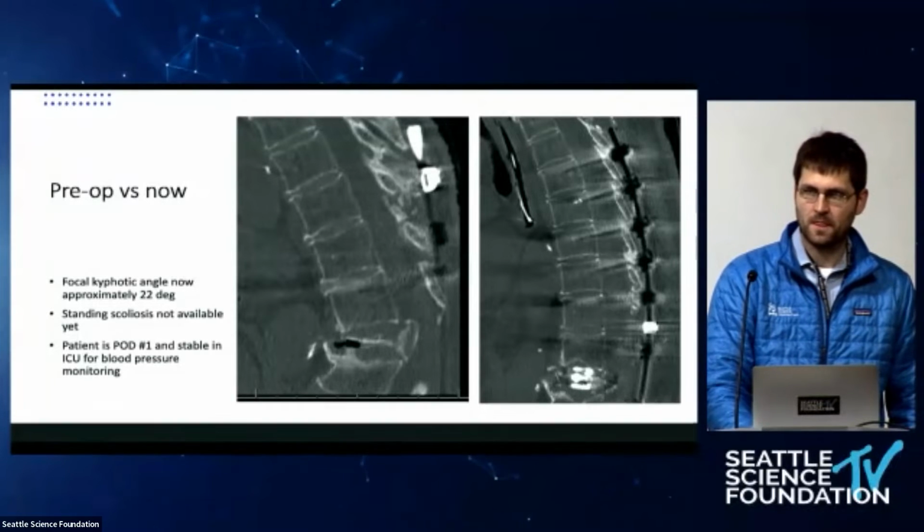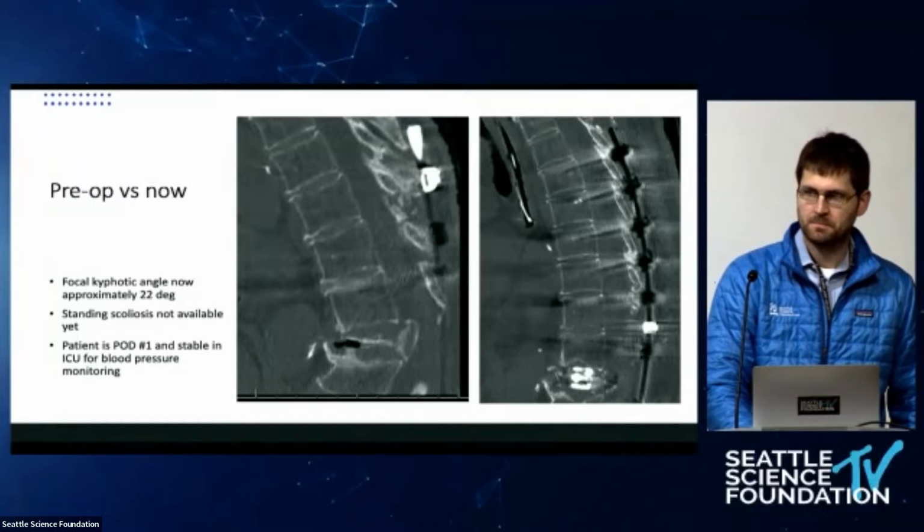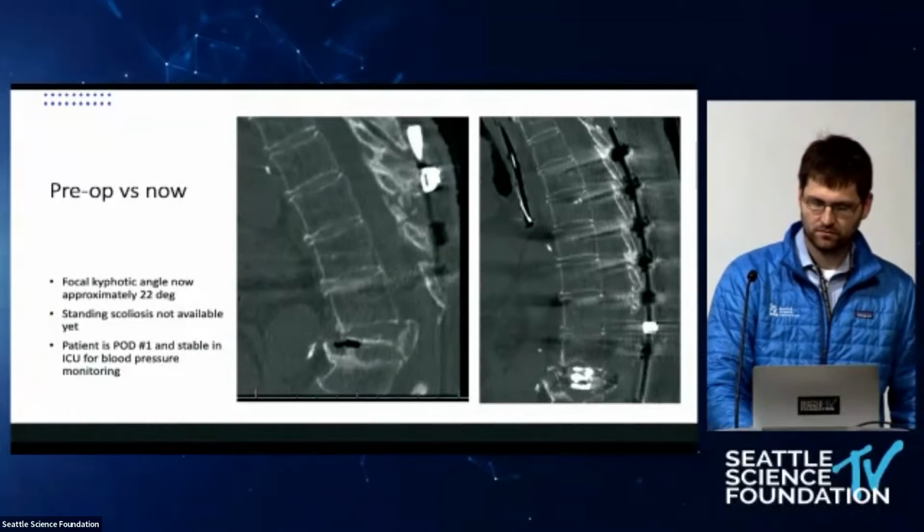And then I don't know if Dr. Sardar, can you see this image? Yeah, I see it. What do you think about the case? And obviously we're dealing with poor bone too. So, her bone quality was not great.